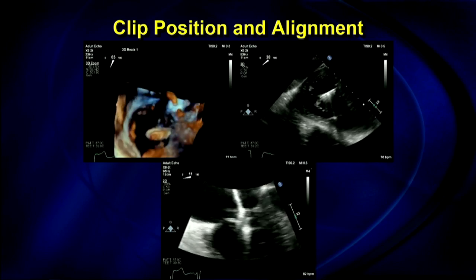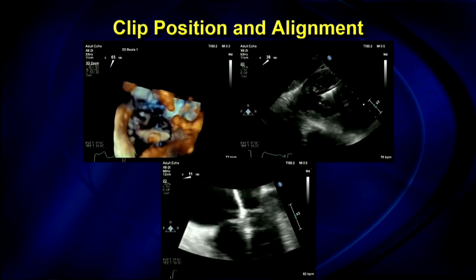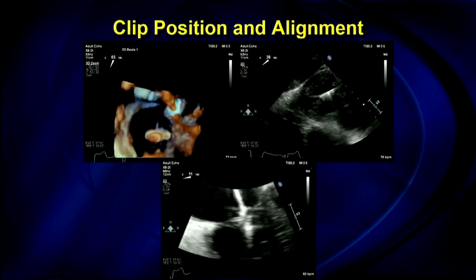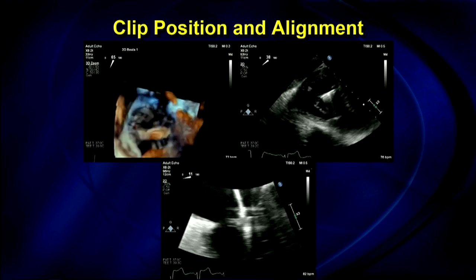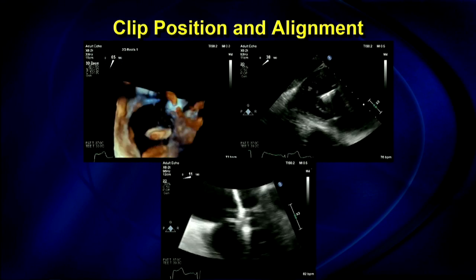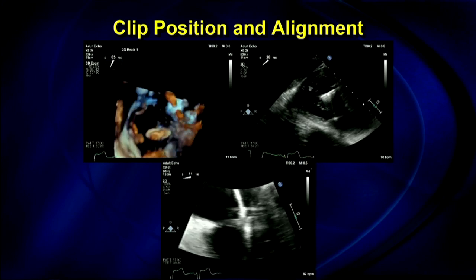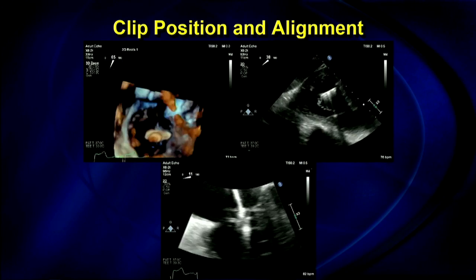So similarly, when you have clip arm alignment, when you're in the RV, you can try to use 3D. It's a little less helpful, but if you can get a nice transgastric short axis view, you can really see where the clip is along the commissure and the clip arm alignment relative to the commissure. And that really sets you up for a good grasp, an effective grasp.